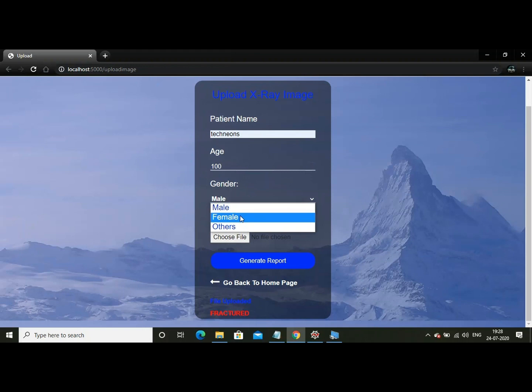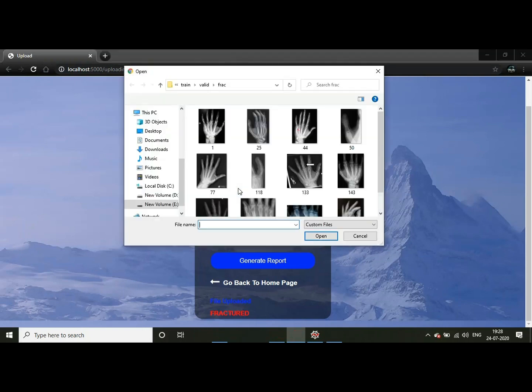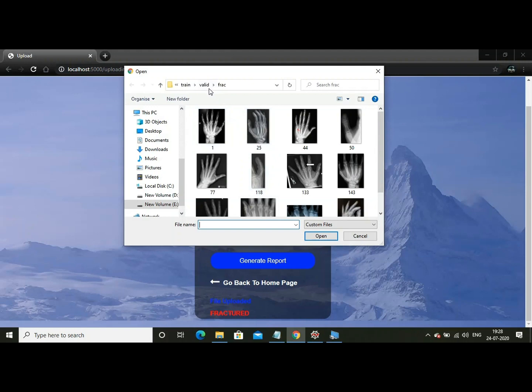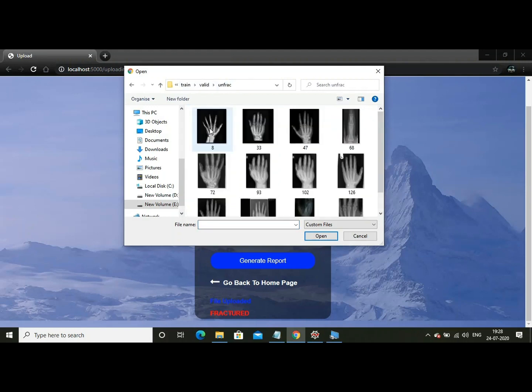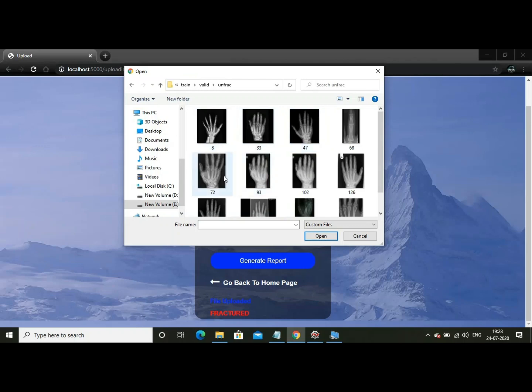This time let it be female. And now I am going to upload a file which is not fractured. Now let us take some random one. This one.